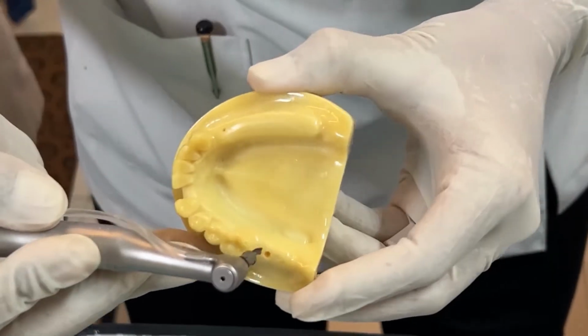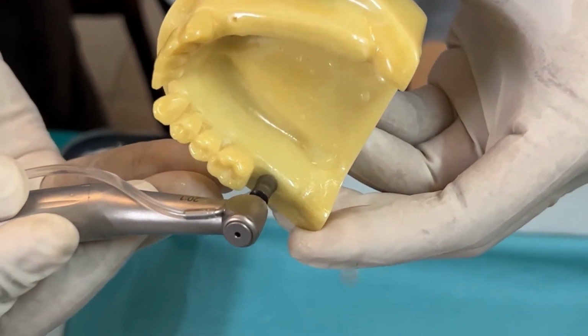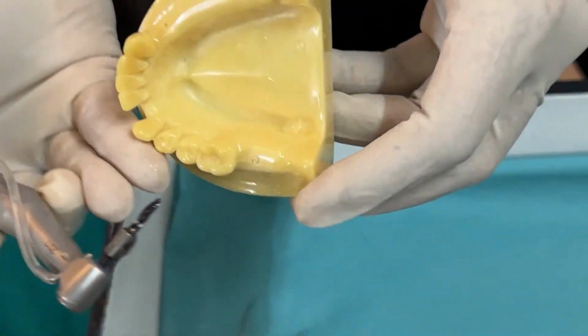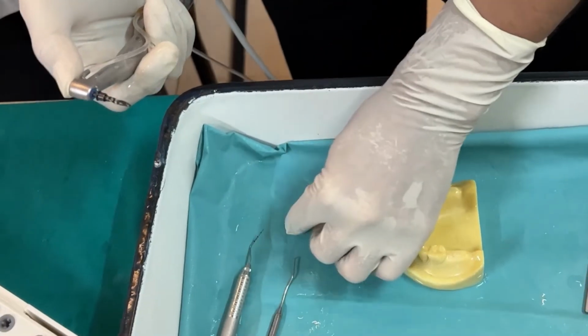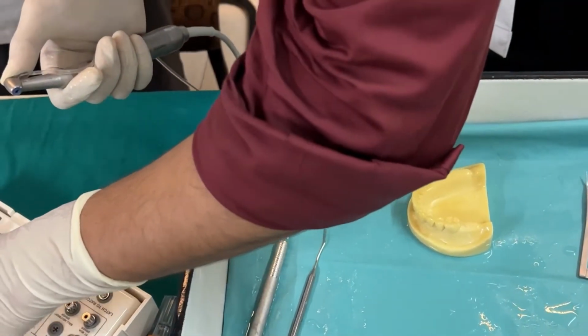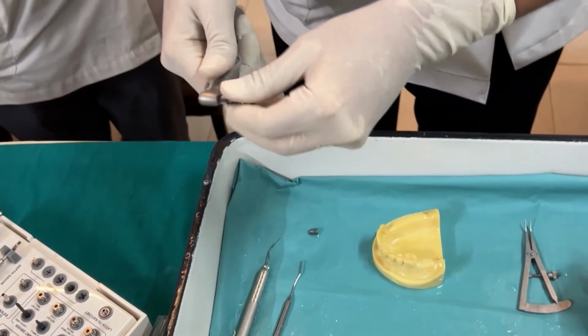So straight away the next drill, take your time and let it go inside. And can you see, now with hardly any resistance it is going inside. All of you are able to see. Okay. So once this has been done, the next drill is 3.2. So the 3.2 millimeter drill we are taking.